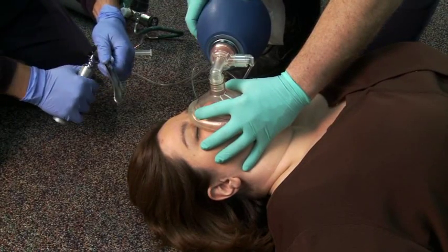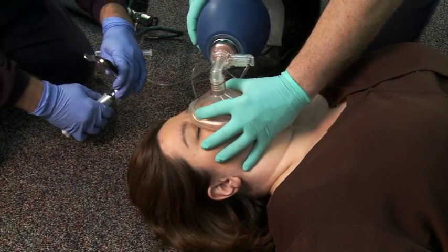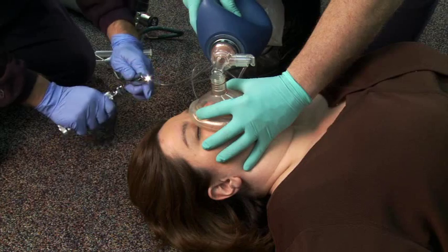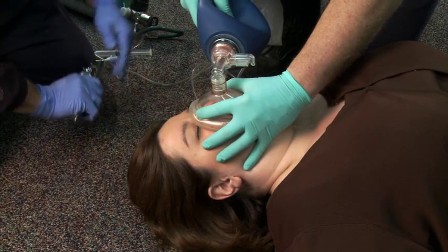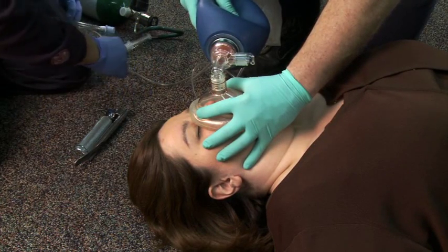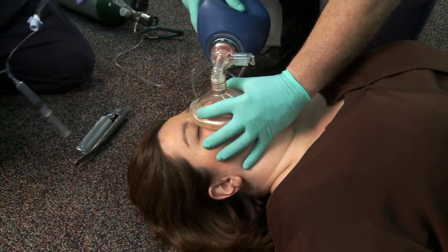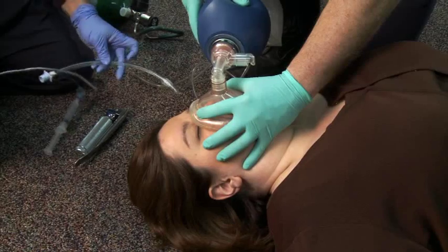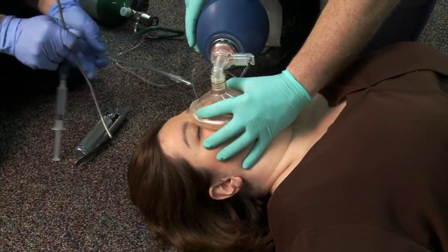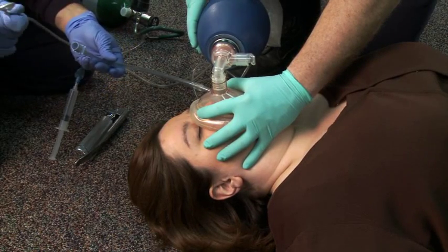Equipment includes multiple-sized endotracheal or ET tubes, laryngoscope and blades, malleable stylet, water-soluble lubricant, and a 10 cc syringe.